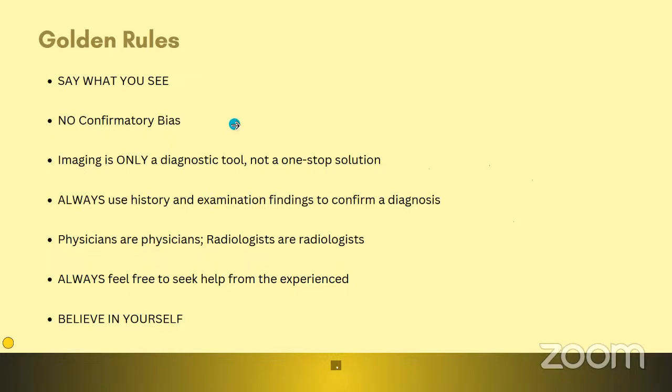Since ultrasonography, though it is non-invasive, has less sensitivity compared to CT and MRI, it needs more expertise, and we need much sharper eyes to look out for all the possibilities. Third one: imaging is only a diagnostic tool. This is applicable for every radio imaging technique. So we properly need history, examination, etc. to guide us throughout the process of diagnosing the condition of the patient.